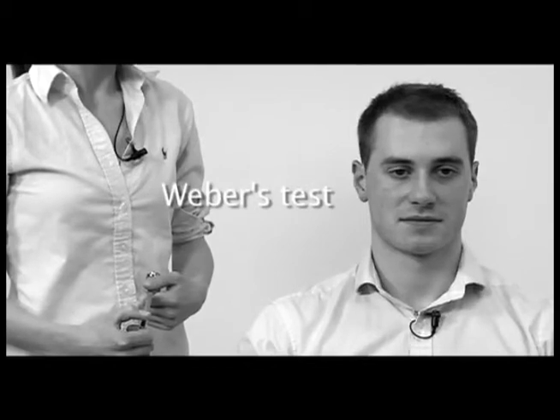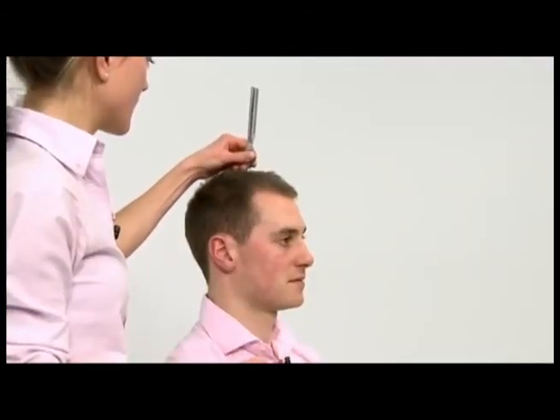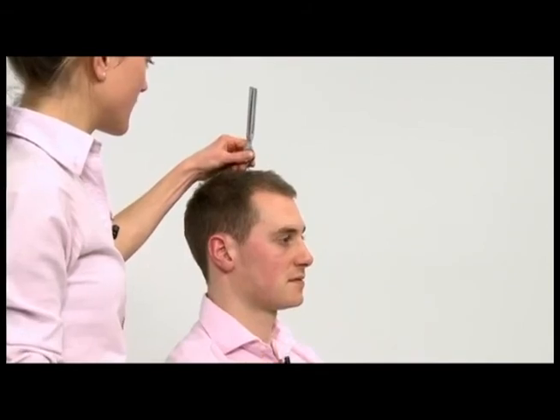Again, it is important to explain the test clearly to the patient. So can you tell me whether you hear the sound loudest in your left ear, your right ear, or whether you can hear it in the middle? Place the base of the tuning fork in the midline. The middle.